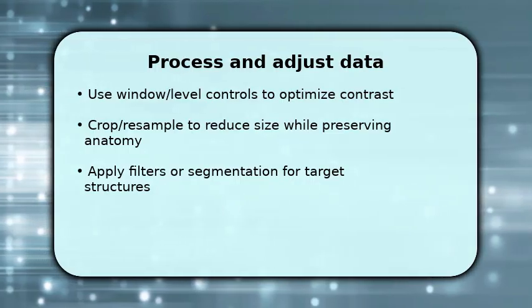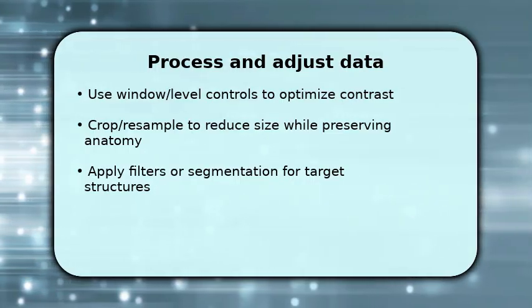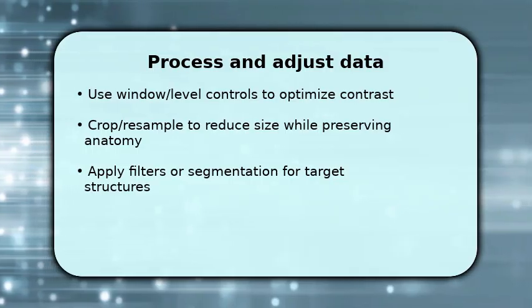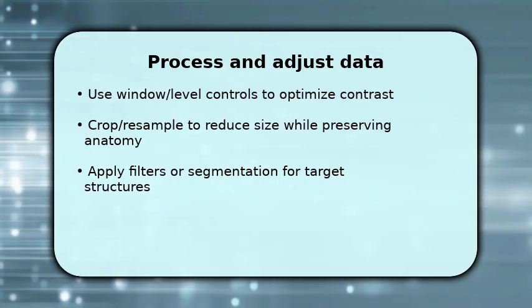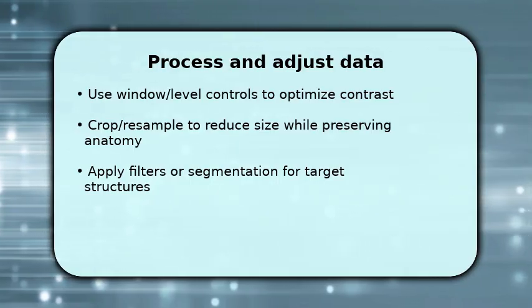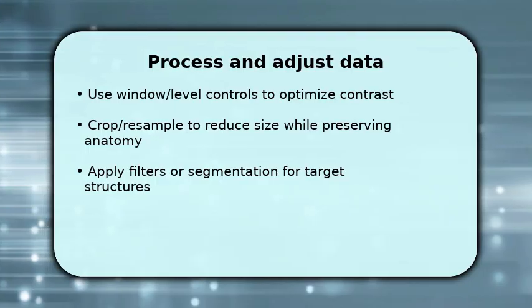Next, crop or resample the volume to reduce file size. Maintain necessary resolution while trimming excess margins. Then apply filters or run a simple segmentation to isolate regions of interest. This makes measurements and exports cleaner.